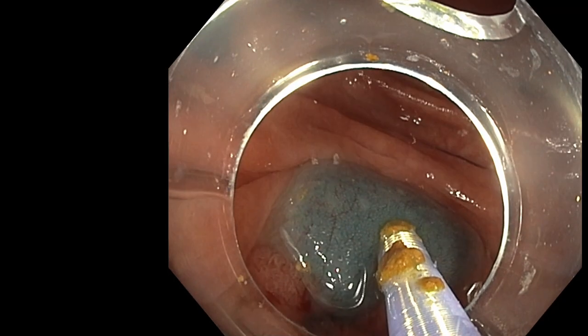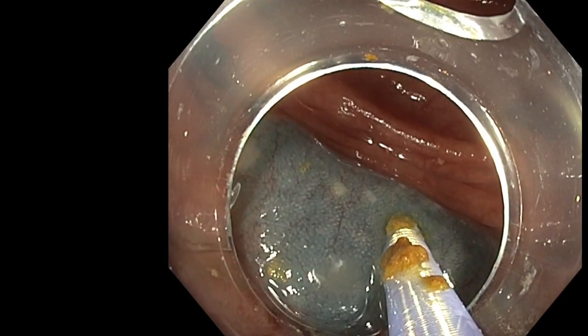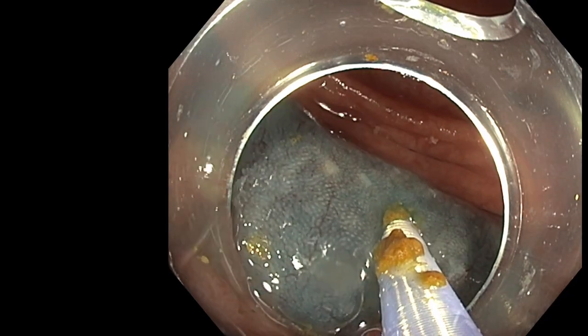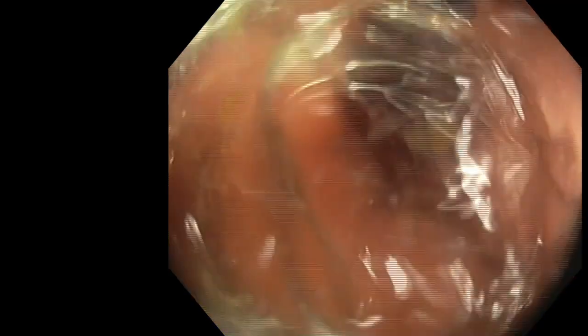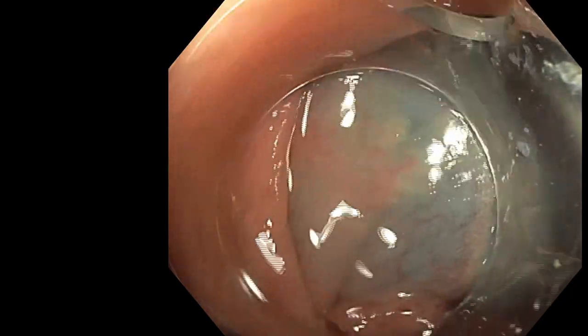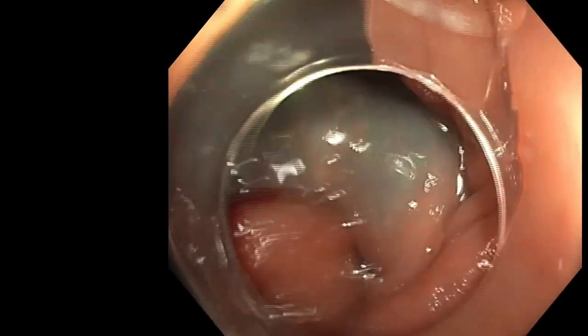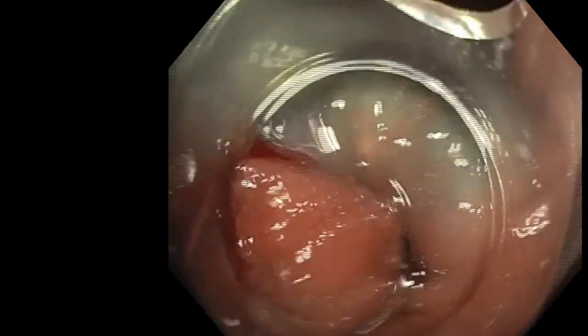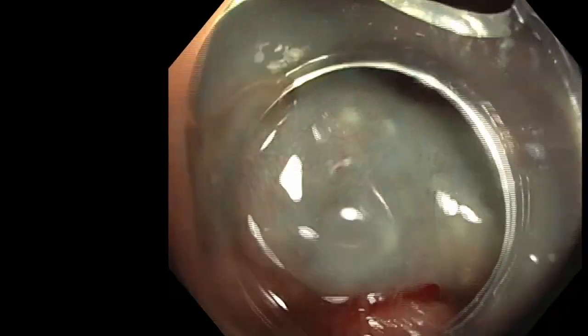So we did, and it's very important, a very strong injection with pressure at the oral edge of the lesion. It's very important to do this incision with a strong, high pressure injection, because thanks to this high pressure, you will be able to do both the incision and the trimming in an opposite way.